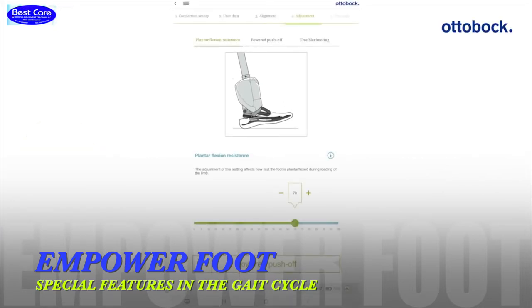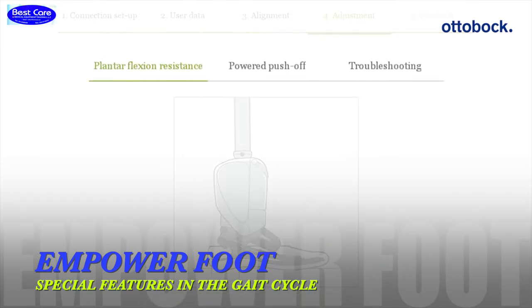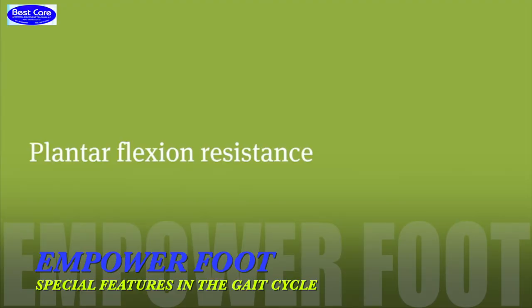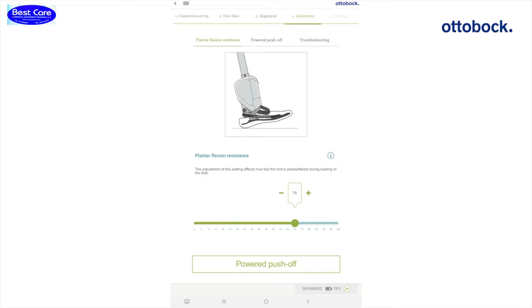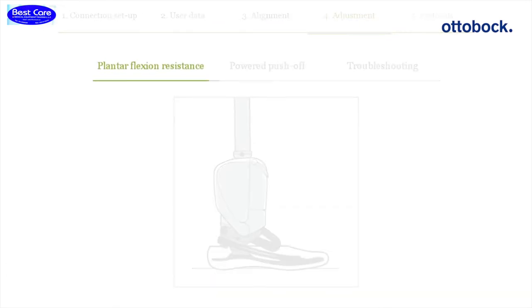The resistance setting of the Empower as well as settings for the Power Push Off can be divided into three steps. The first step is the adjustment of the resistance at heel strike, hence the plantar flexion resistance.